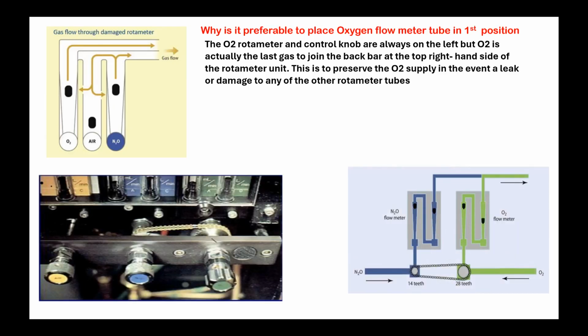Now, what is this picture showing you? What is the name for this? Link 25. It's called Link 25. Very good. Why do you call it Link 25? What are the mixture of gases being delivered? In that, 25% will be oxygen. You are assured of 25% of oxygen.